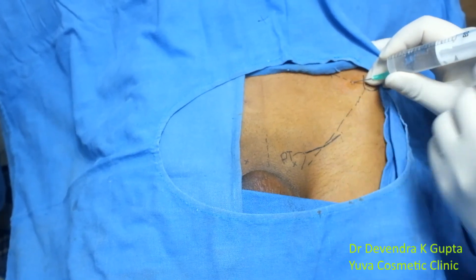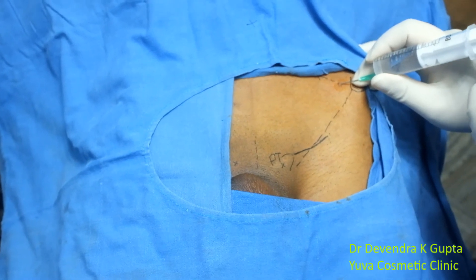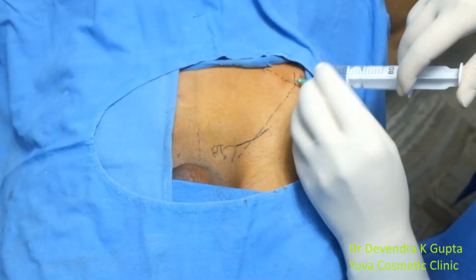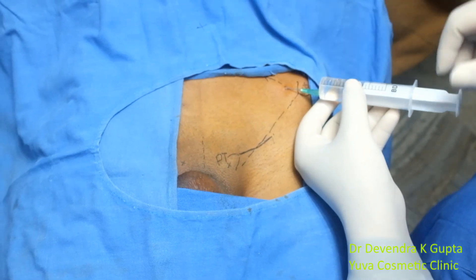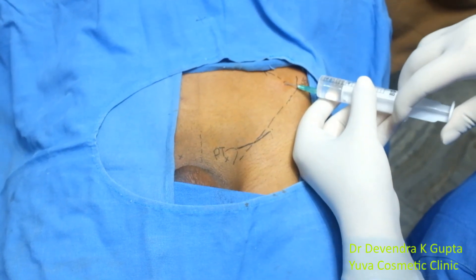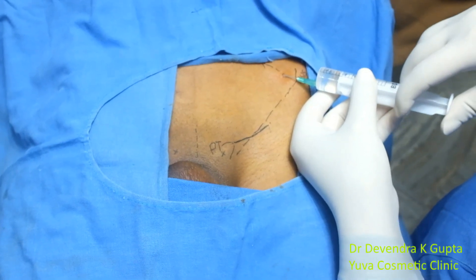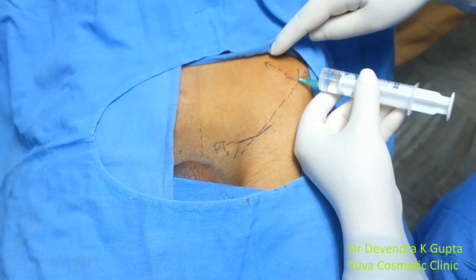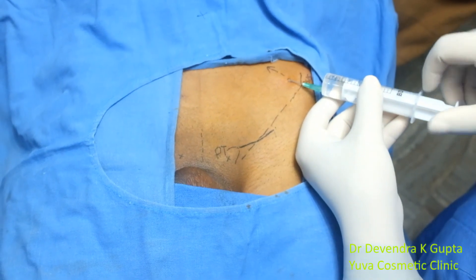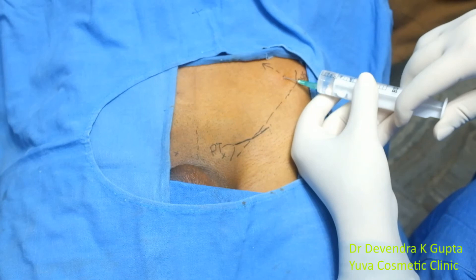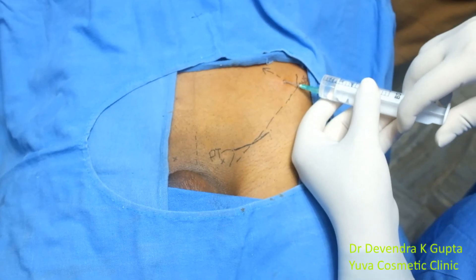A clear-cut pop is confirmed. Stabilize it, aspirate, and then inject, keeping the direction of the needle towards the umbilicus. The needle is in between the external oblique and the internal oblique — there is no ballooning, which means the injection is not subcutaneous but is in fact between the internal oblique and external oblique.